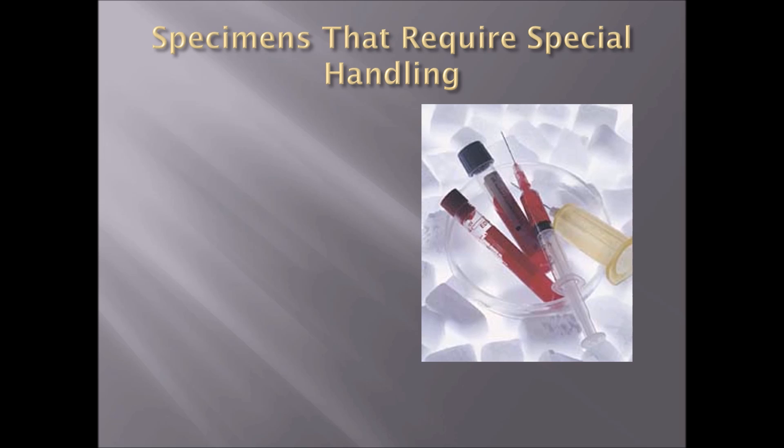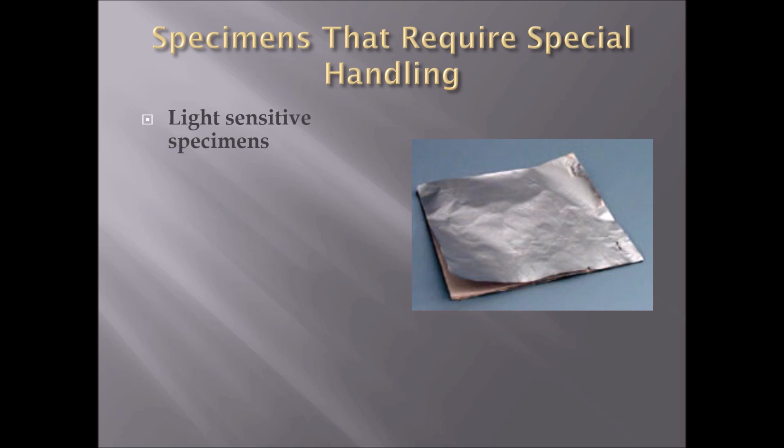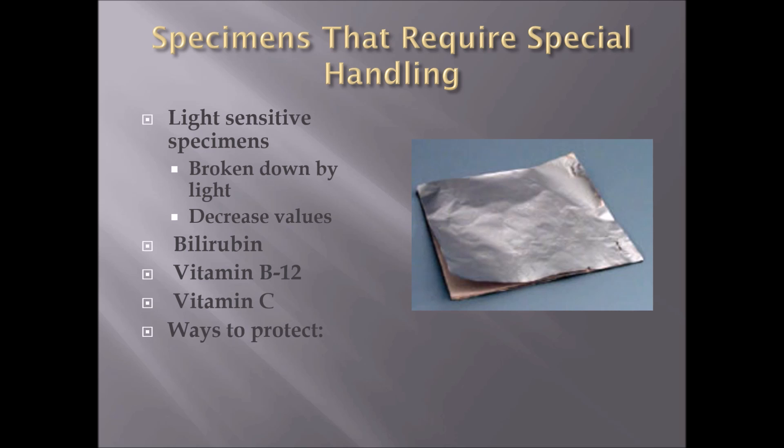Let's talk about specimens that require special handling for temperature and light, which can affect analysis. Chilled specimens — part of metabolic processes like ABGs, ammonia, glucagon, and parathyroid — must be put on crushed ice. Light-sensitive specimens, if exposed to light, can be broken down and decrease values within the blood cells — examples include bilirubin, vitamin B12, and vitamin C tests. Ways to protect these include using aluminum foil or an amber container that protects the blood cells from light. These are special handling requirements when dealing with certain types of tests within a lab.